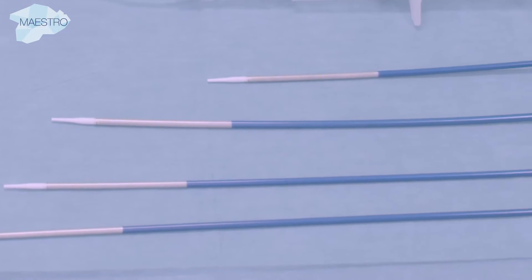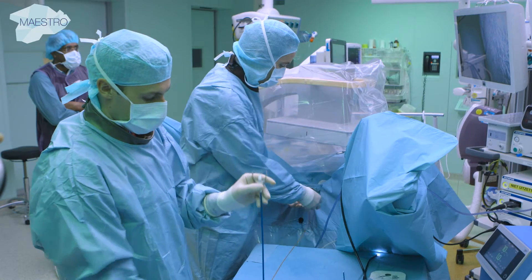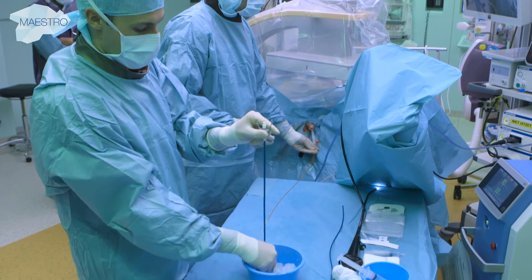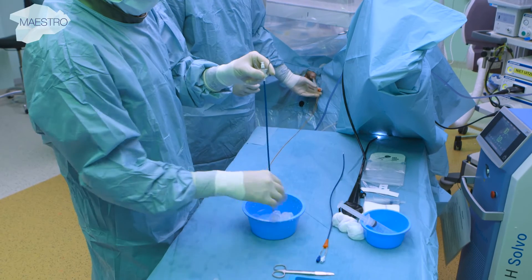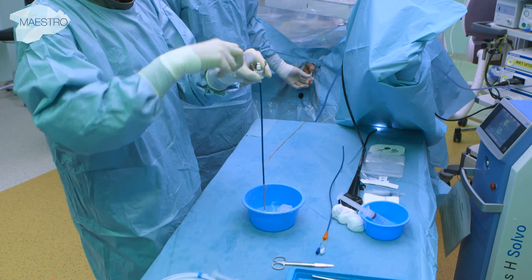Ureteral access sheaths are used to facilitate continuous access to the collecting system for multiple scope passages during stone procedures. Flushing the sheath with sterile water activates a hydrophilic coating that allows smooth and easy placement.